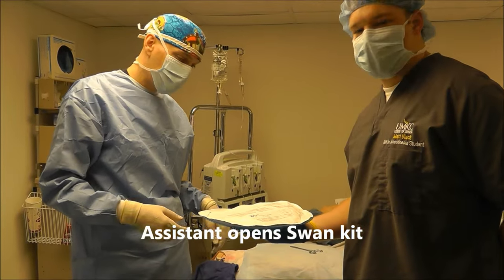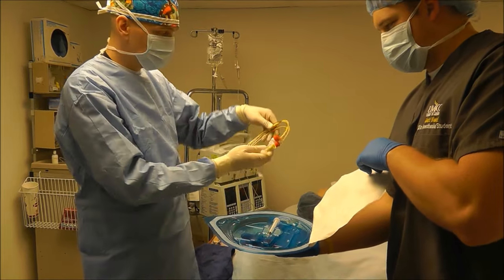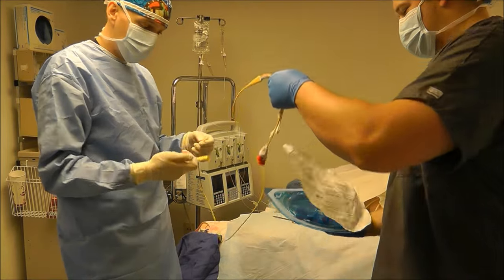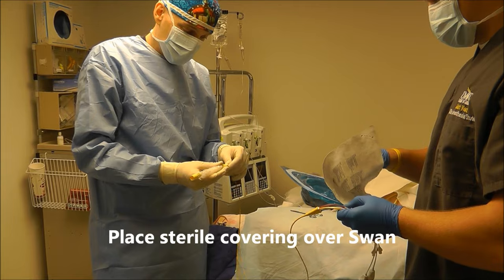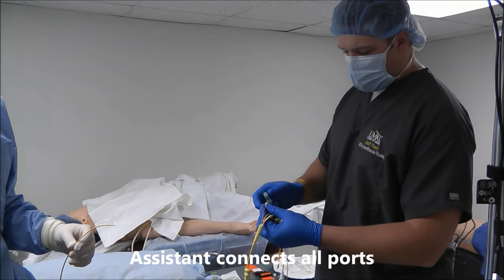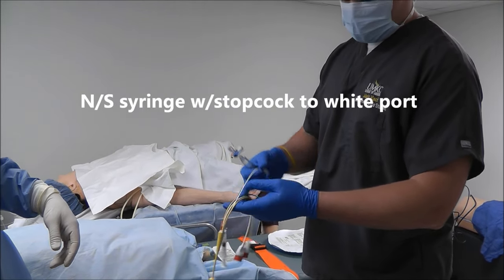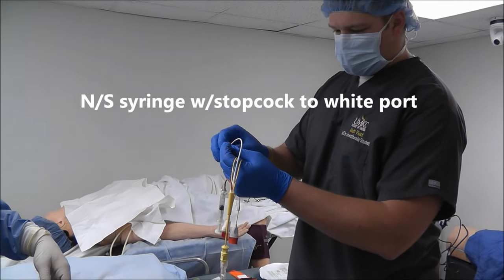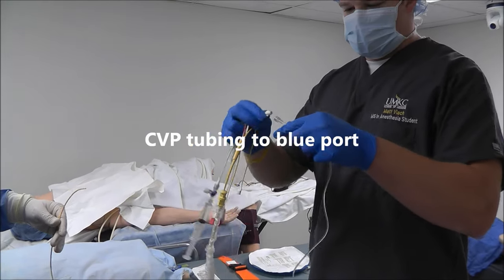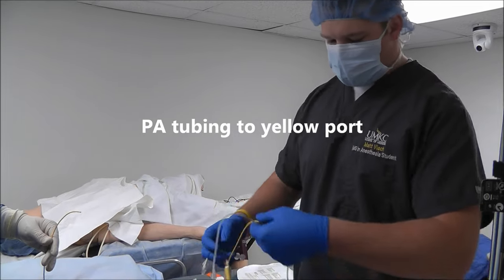Now that it's sewn into place, it's time to float our Swan, so I need an assistant here to help me. While he's taking care of that, I'm going to put this sterile cover over this one. I'm going to hook up this syringe to the balloon port — the red port right here. Now I'm going to hook up this saline to the white port, my CVP tubing to the blue port, and my PA tubing to the yellow port here.